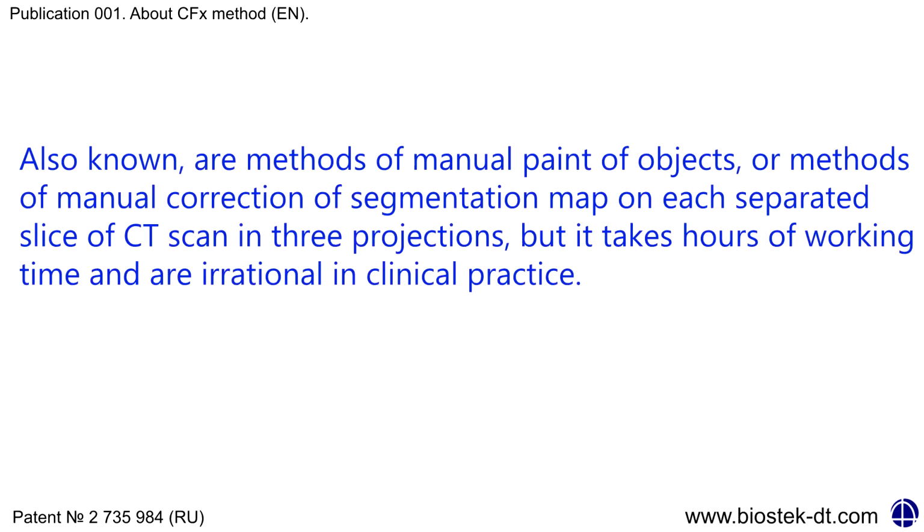Also known are methods of manual painting of objects or methods of manual correction of the segmentation map on each separate slice of the CT scan in 3 projections, but it takes hours of working time, and those are irrational in clinical practice.